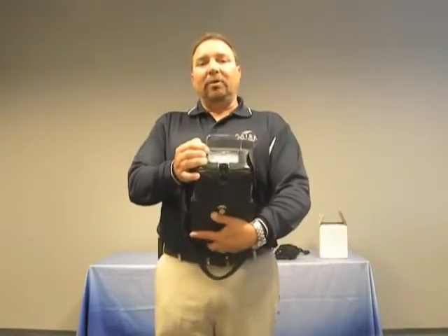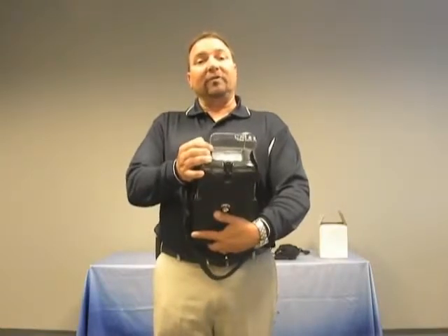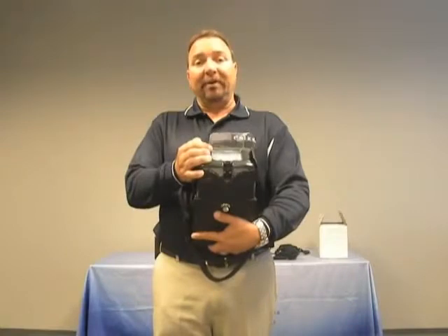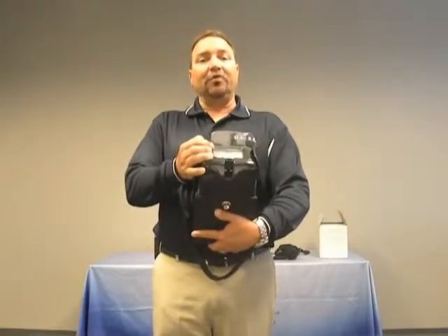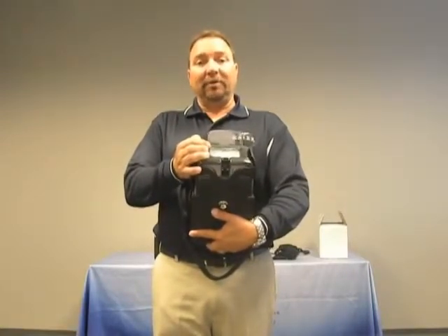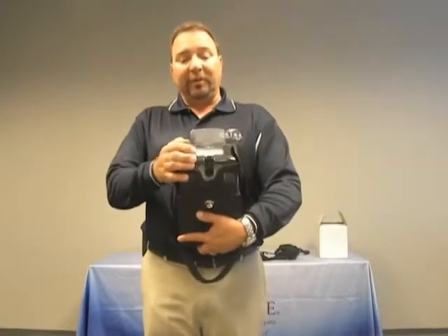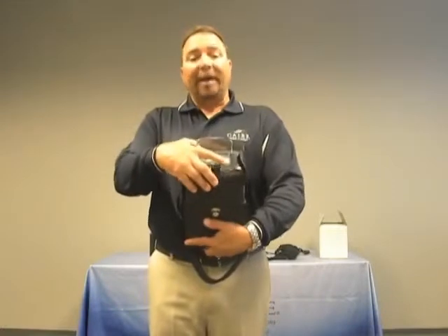In this video, we are not only going to provide you with identifiers of all alarms, but also on how the patient should use the air belt in the event they are using it for travel or needed extended periods of time using battery. The first alarm that we would want to identify is a low battery alarm.